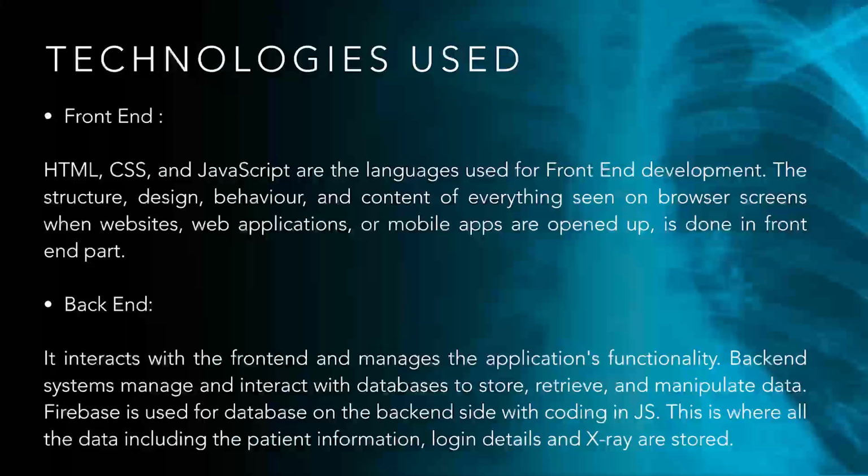Backend. It interacts with the front-end and manages the application's functionality. Backend systems manage and interact with databases to store, retrieve, and manipulate data. Firebase is used for the database on the backend side with coding in JS. This is where all the data, including the patient's information, login details, and X-rays, are stored.